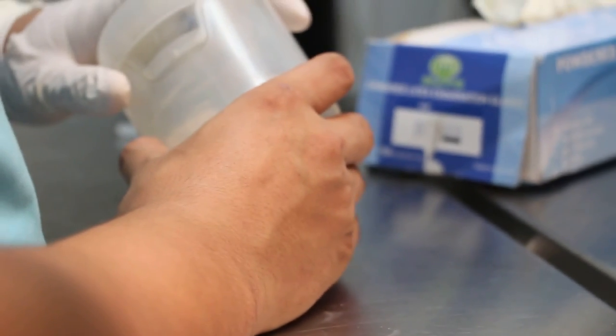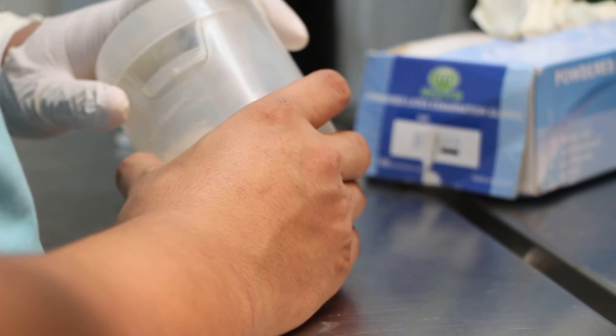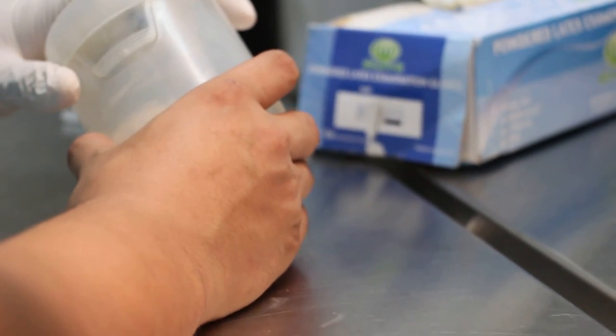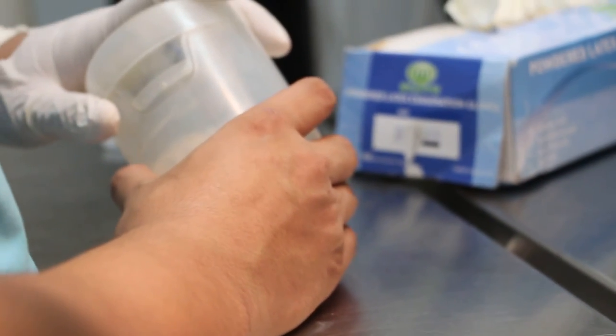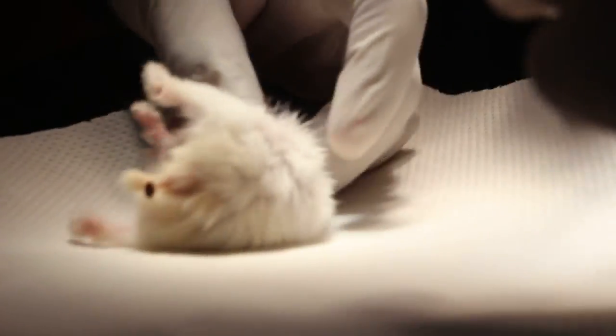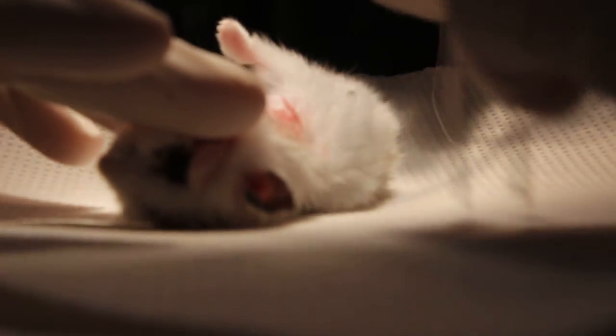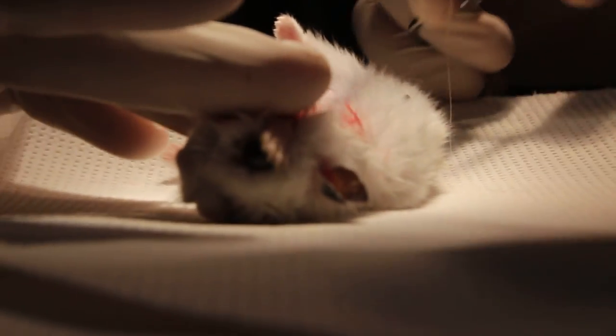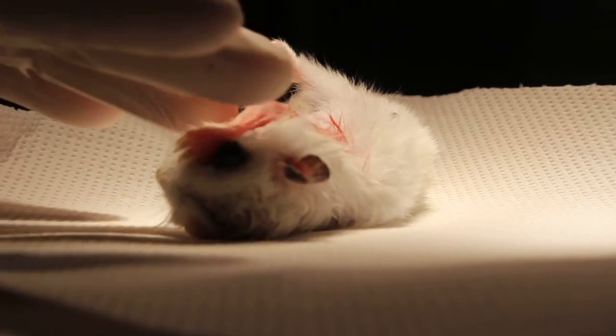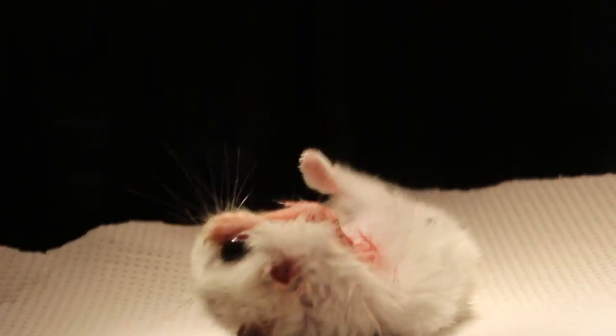When you see the hamster... Okay come. It should be facing my side, not facing your side. In fact you should come this side. Come this side.